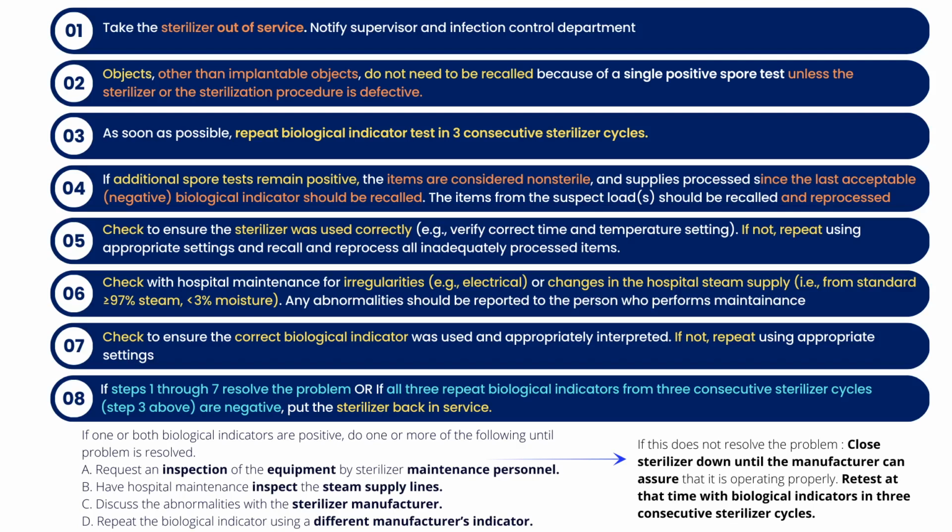Once they assure you, you have to retest again with the biological indicator for 3 consecutive sterilizer cycles.